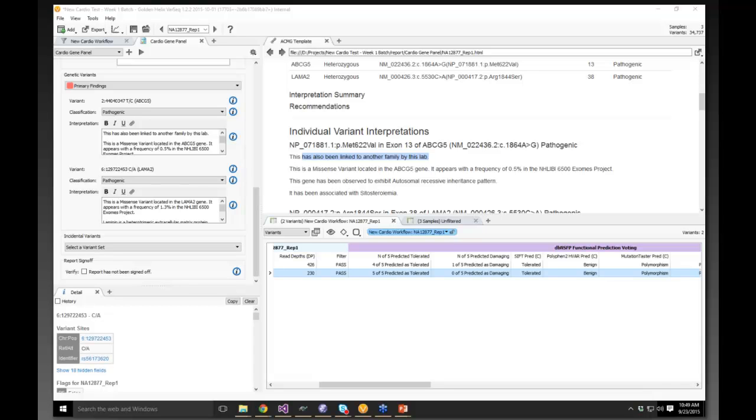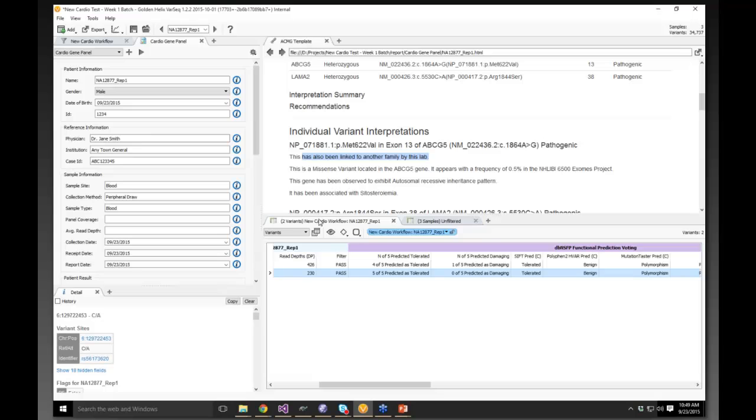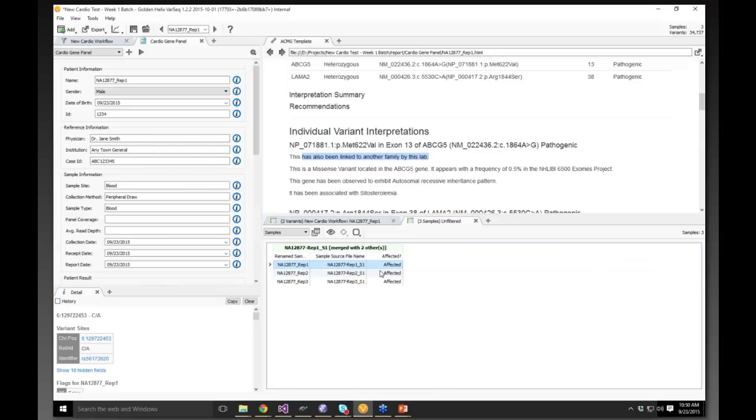How is patient information entered into the report? Can it be queried from a database or imported from an Excel file? Yes, so this information here is being imported based on what I have as a default set of fields from my sample.